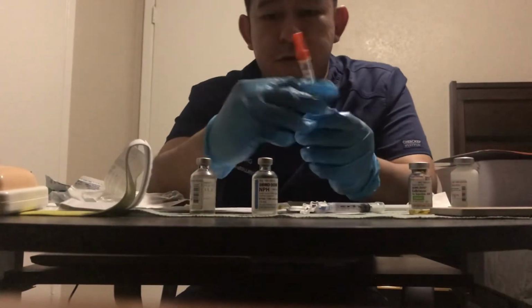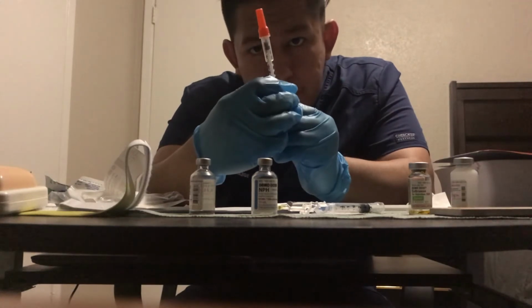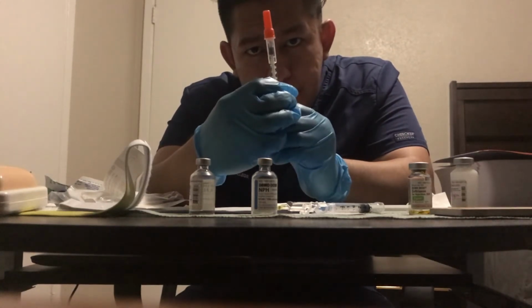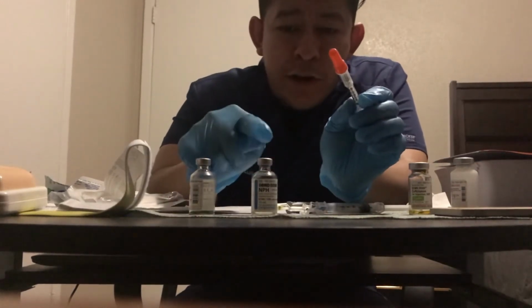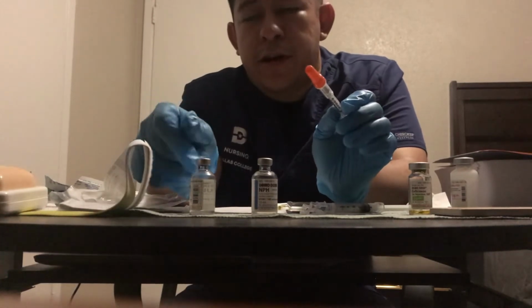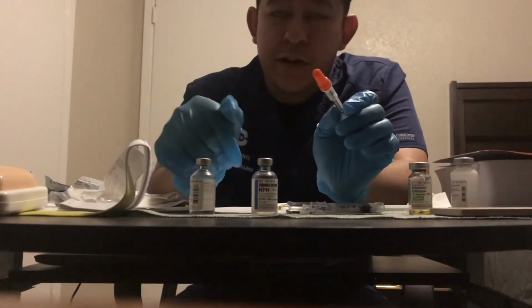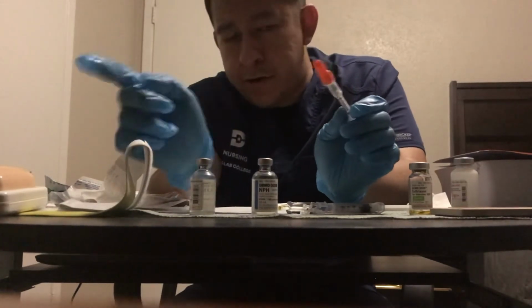And then you're going to draw up 12 units of air. And you're going to inject 12 units of air into NPH and then 12 units of air into regular. And then draw 12 units from regular and draw 12 units of insulin from NPH. So NR to RN.